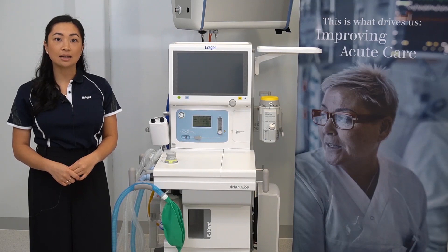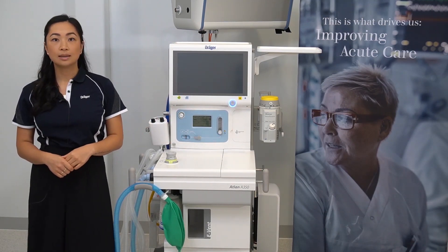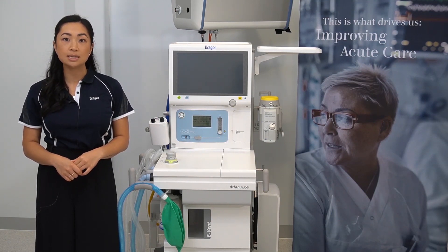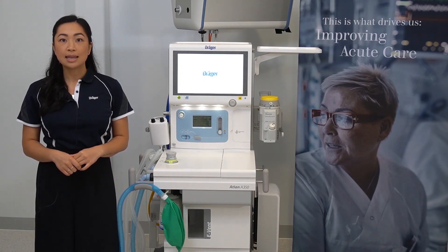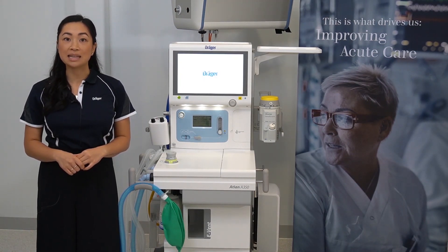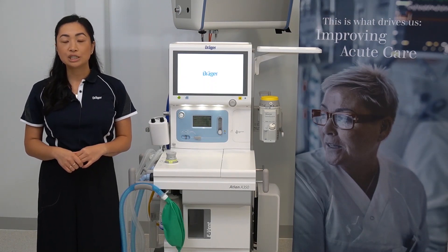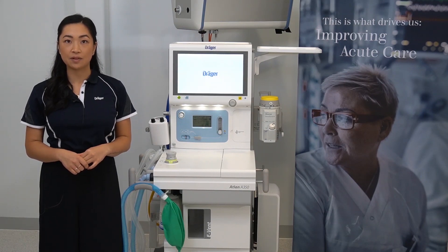To start, turn your device on. A system test will need to be performed every 24 hours or every time the device is turned on. The system test lasts for approximately eight minutes but can be cancelled in the event of an emergency. Just keep in mind you'll need to perform a system test at the next earliest convenience.